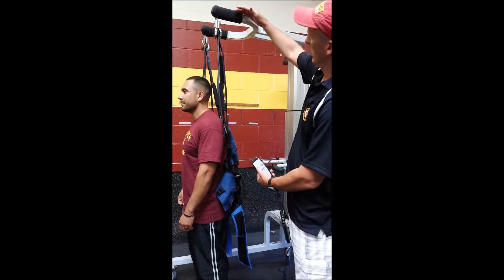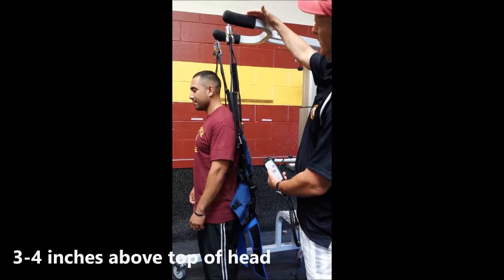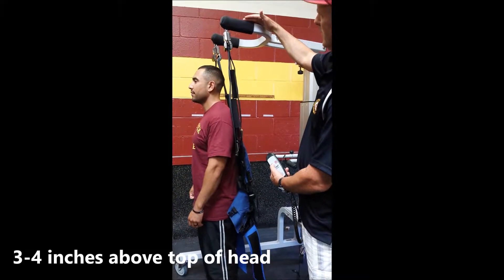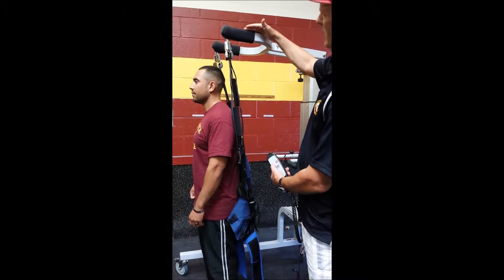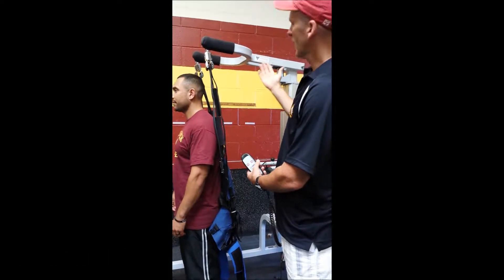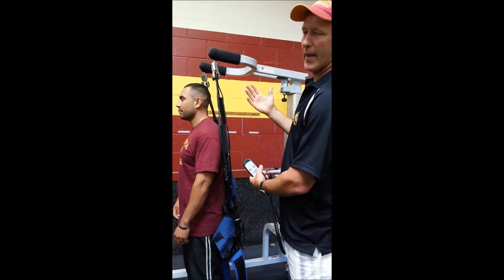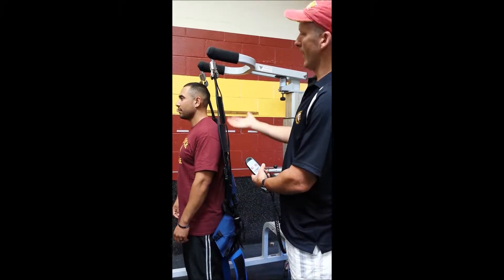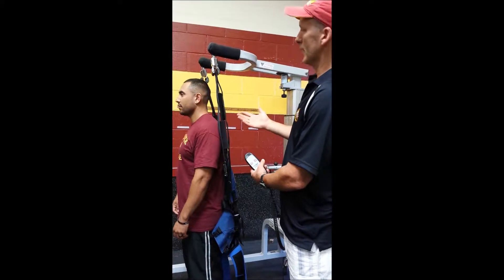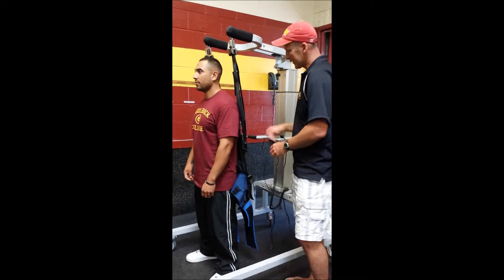I'm going to bring this down to where it's about three or four inches above Tim's height. This is made to work with, say, your basketball athlete that's six foot eight in height, maybe coming off an injury where they had to be non-weight-bearing. So I might have an athlete that actually uses this to run, instead of the example I'm giving of using it just to work on walking skills. So we've got it at the right height.